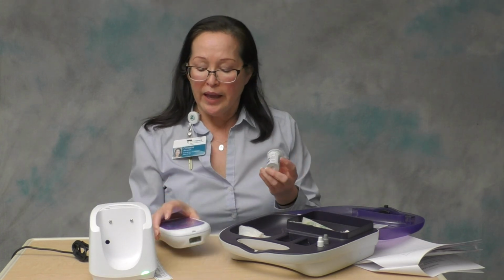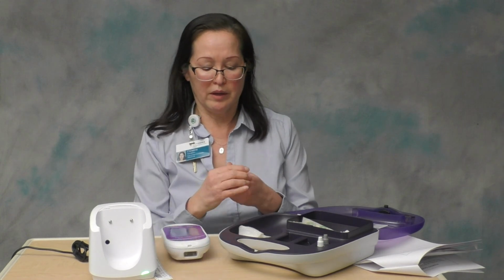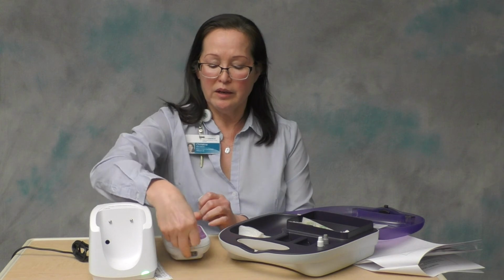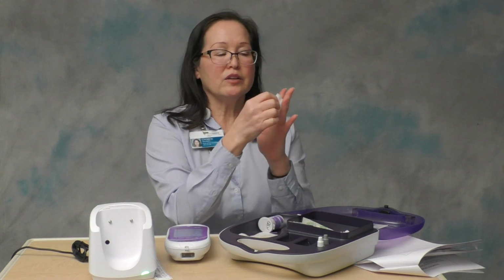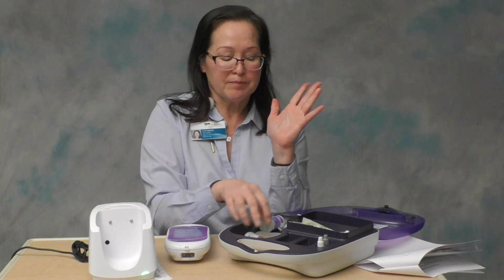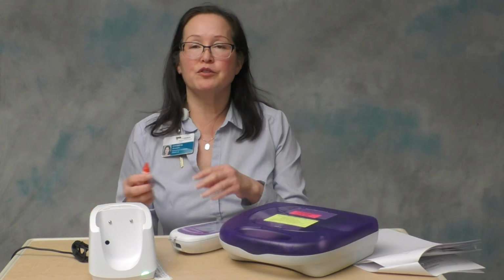We'll scan that, and then you're going to get the little icon of the strip going in there. So now I'm going to put the strip in, and then you're going to obtain your patient sample. So you're going to alcohol the finger, dry it or let it dry. This one, well, you saw me pull the pin out. I'm just using this as a demonstration. Of course, you're going to have gloved hands. You're going to make sure that the longitudinal axis is perpendicular to the fingerprint lines, and then you're going to lance. You're going to wipe away the first drop of blood, and then you can use the second and subsequent drops of blood for your patient test.